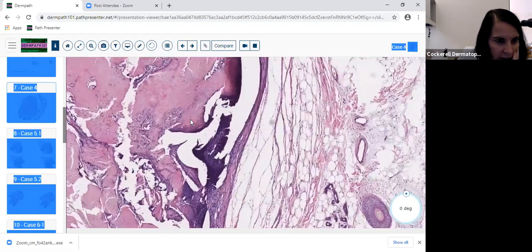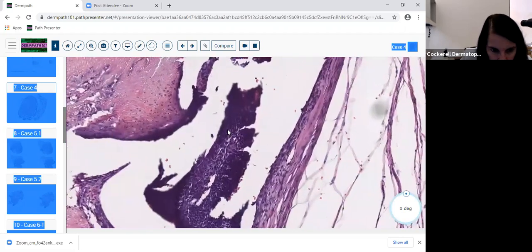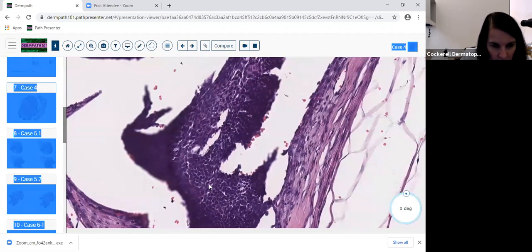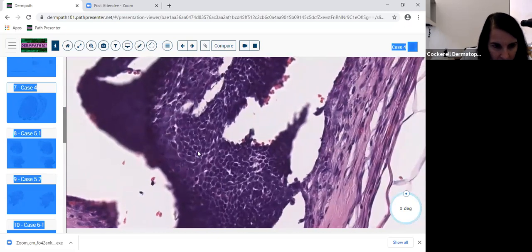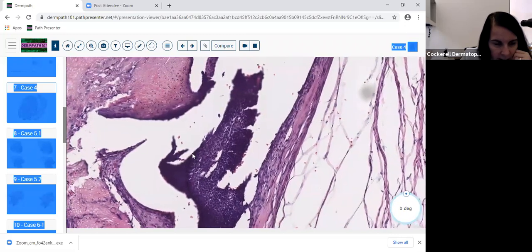I like to show this slide because sometimes we don't get very good biopsies. We'll only get a tiny little piece and we'll get just these cells here, and it's very hard to differentiate from a basal cell. But you have these basophilic cells here and they're very basaloid. There are indistinct cytoplasmic borders, hyperchromatic nuclei. You can see occasional mitoses, and you start to think, well, maybe this is malignant.